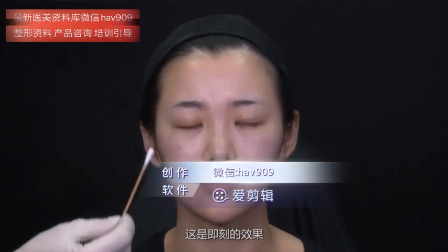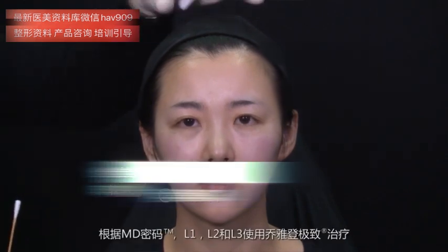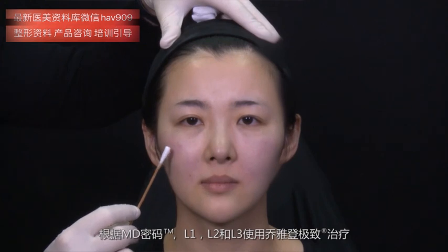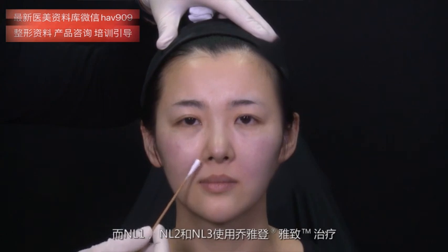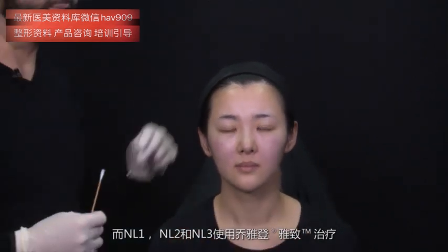So this is the immediate result of the MD Codes L1, L2, L3 with Juvederm Ultra Plus, and NL1, NL2, and NL3 with Juvederm Ultra.